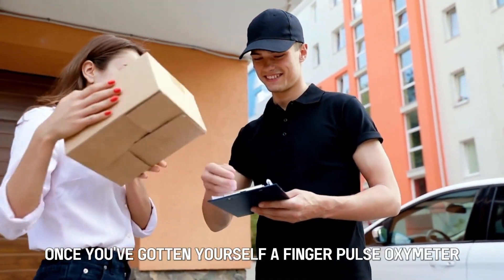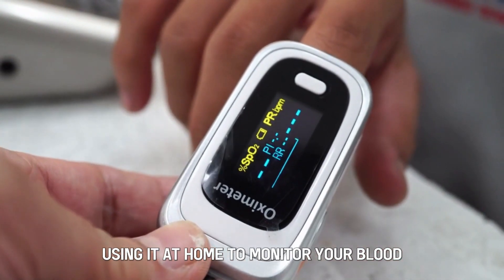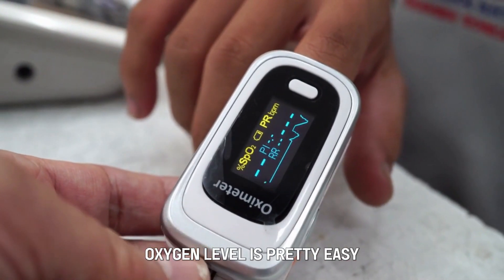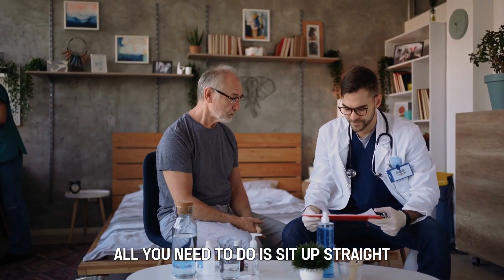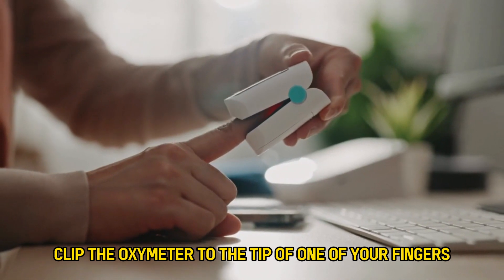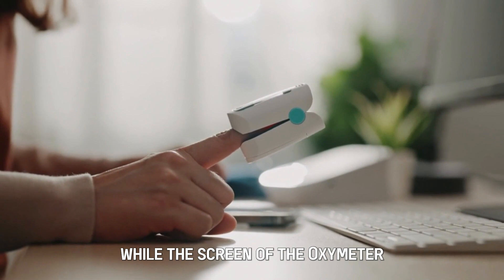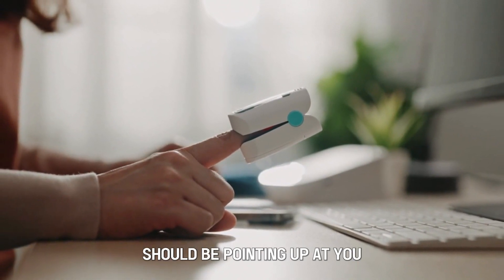Once you've gotten yourself a finger pulse oximeter, using it at home to monitor your blood oxygen level is pretty easy. All you need to do is sit up straight and clip the oximeter to the tip of one of your fingers. Note: your palm should be facing down while the screen of the oximeter should be pointing up at you.